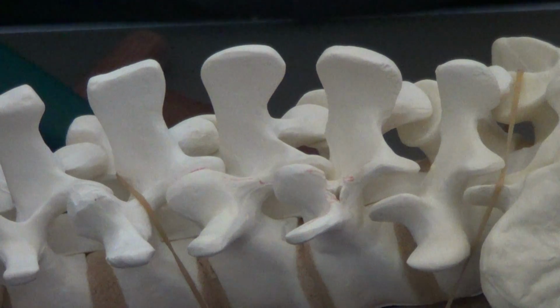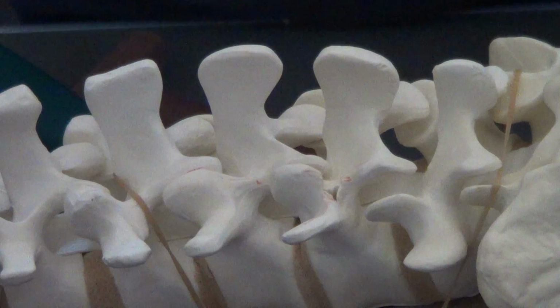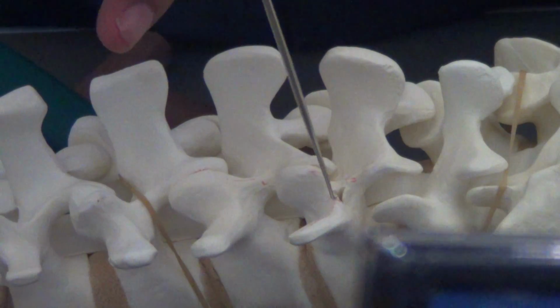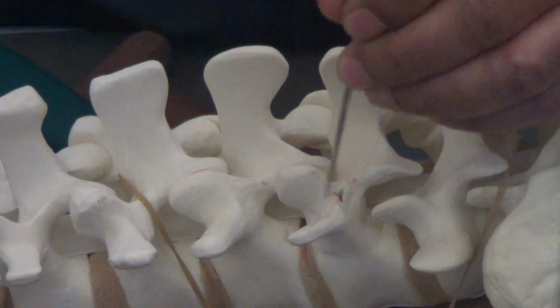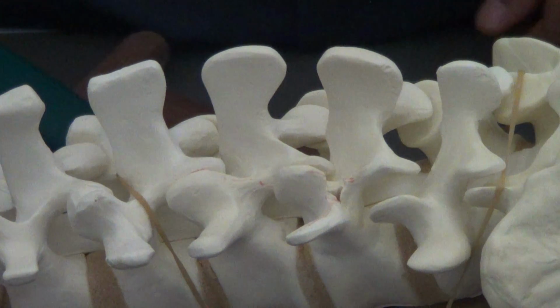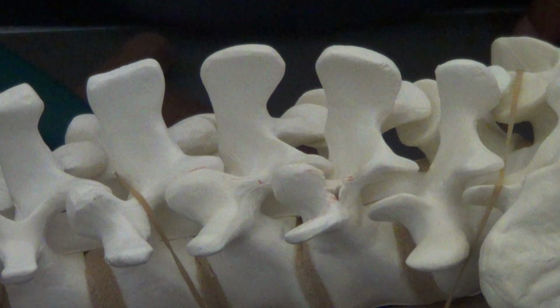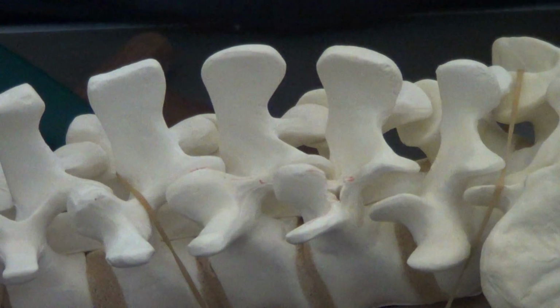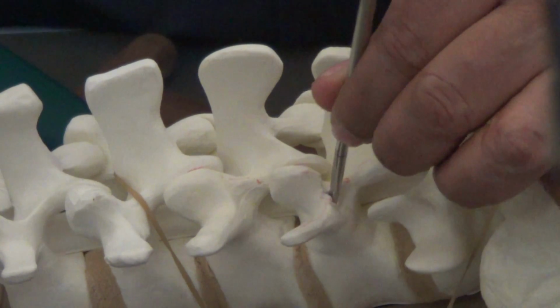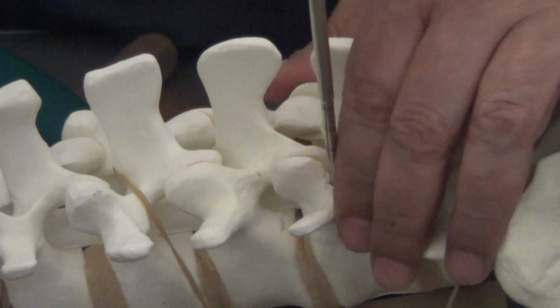So you must always sound. Where's the sound? Use this as a sound. Usually at the tip there's a sound there. So you go inside and try and feel your walls. So once you are inside, then you take your probe. Not that awl, this probe. Yeah, probe. Okay. So you go in, and again the same direction, 10 degrees angle here. This is L4, and slightly caudal, 10 to 15 degrees.